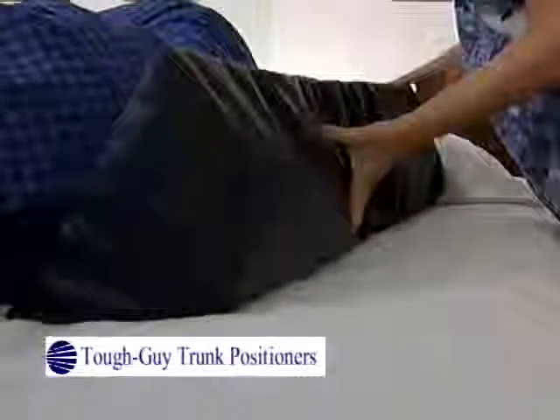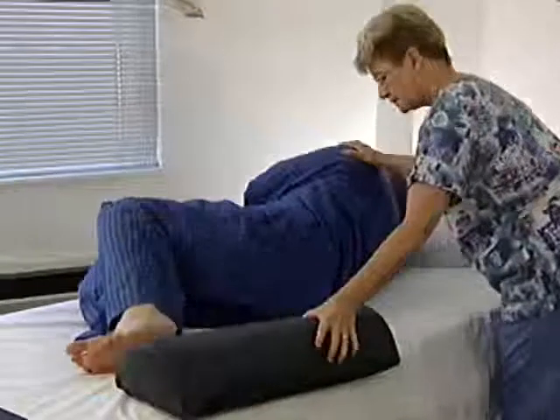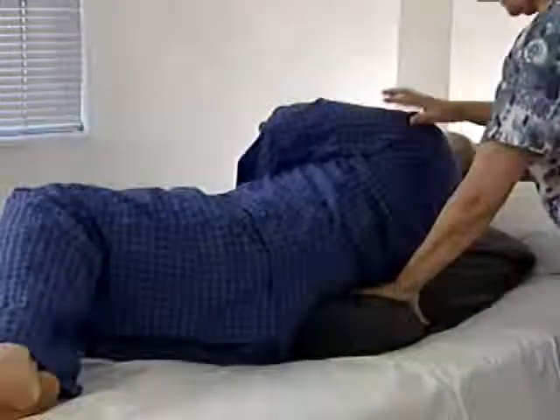Welcome to the in-service for Tough Guy Trunk Positioners. Tough Guy Trunk Positioners are designed to help you position a patient appropriately and to help maintain that position.